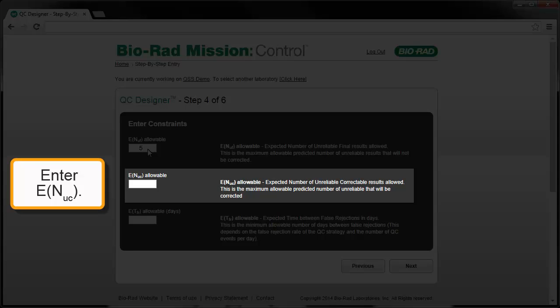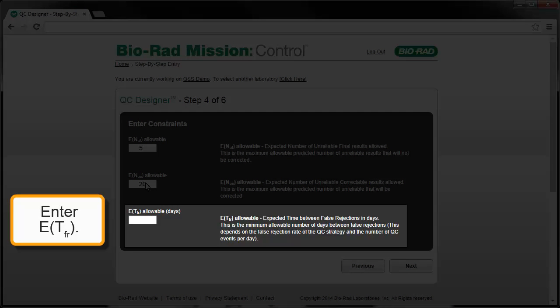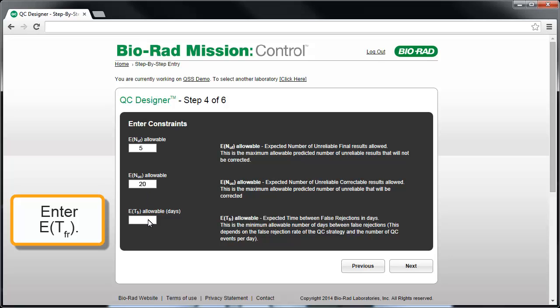While the tendency might be to input a very low number for ENUC, consider that this may not be a realistic design constraint. Rather, start with a value of about half the average number of specimens examined between QC events, which will allow more flexibility in finding a QC strategy solution. This ENUC allowable is set as a default for all analytes on this instrument, but the value may be adjusted later for individual analytes. The third entry in Step 4 is the minimum allowable EDFUR, which represents the expected time in days between QC false rejections. QC strategies will be sought with predicted lengths of time between false rejections that are greater than or equal to the minimum allowable EDFUR. To allow flexibility in finding a QC strategy solution, consider starting with an EDFUR value of 30 days. Click Next.